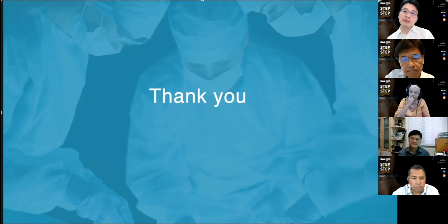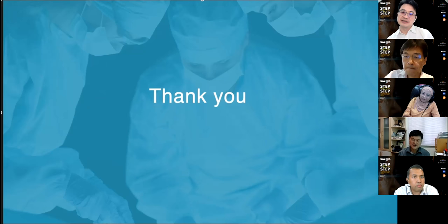What are the brands available in PVDF now in Malaysia? Now we have a lot already. We used to have problems getting the PVDF haptic. Now you can get it from iCrew, one of the brands. The other one is from COWA. COWA is interesting because it's preloaded and the lens comes out in a horizontal manner. You don't have to twist and turn.